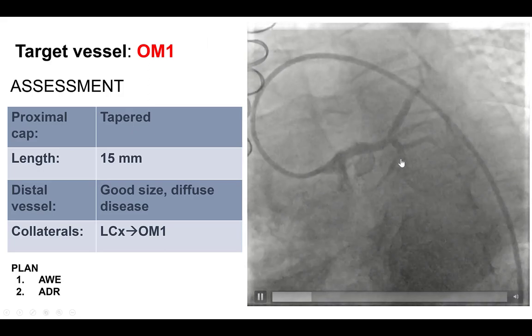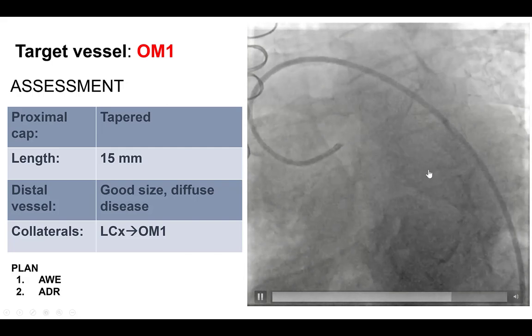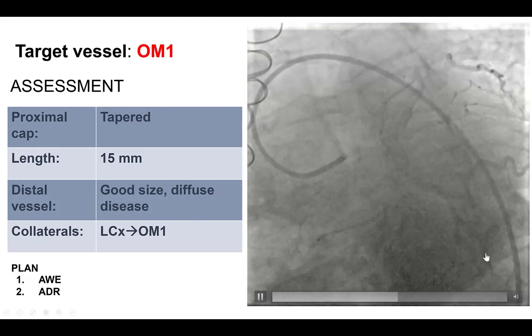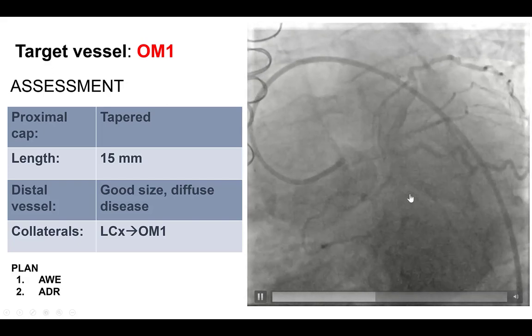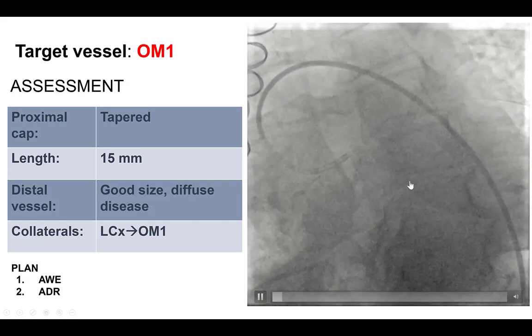He was therefore referred for a second attempt for PCI of the circumflex CTO. He does have a well-defined proximal cap. The length is not very long. There are some collaterals that are epicardial, that don't seem to be suitable for the retrograde approach. Therefore, the plan here was antegrade wiring, and then antegrade dissection re-entry in case of extraplaque wire entry.